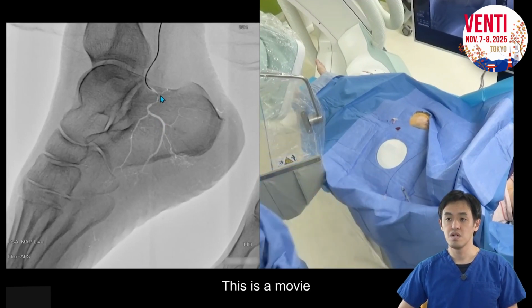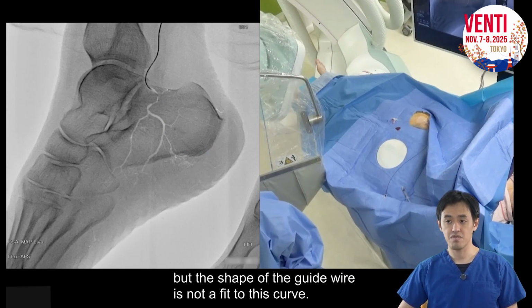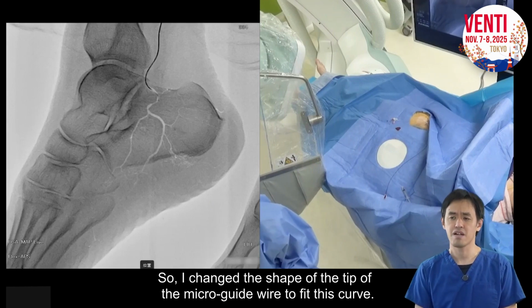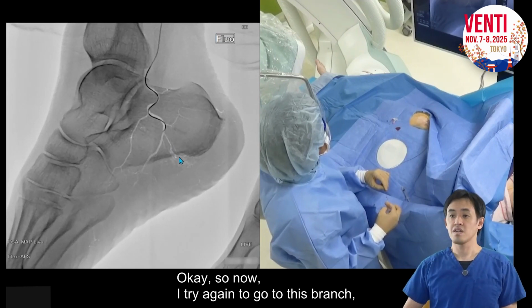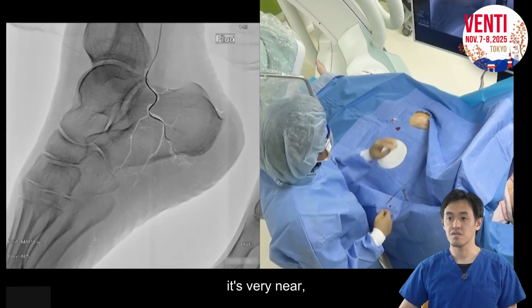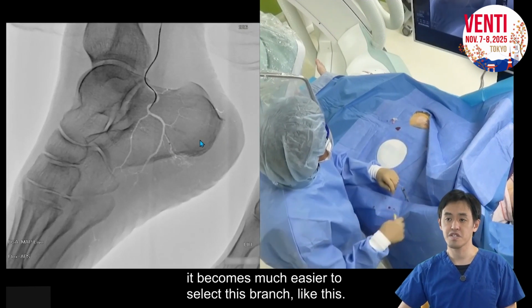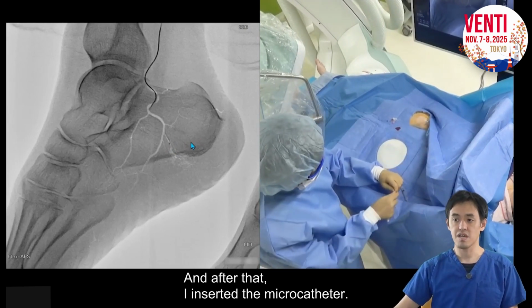This is a movie during the selection using the micro guide wire, but the shape of the guide wire does not fit this curve. So I changed the shape of the tip of the micro guide wire to fit this curve. Okay, so now I try again to go to this branch, the calcaneus branch. It's very near, and we shaped the guide wire to a sigmoid shape, and it becomes much easier to select this branch, like this. And after that, I inserted the microcatheter.